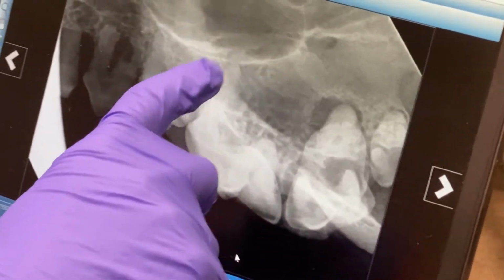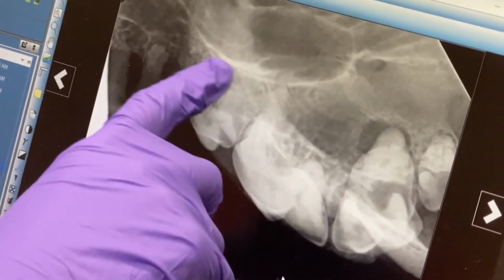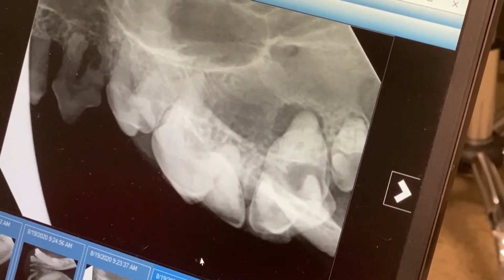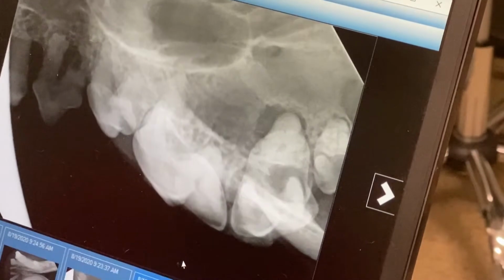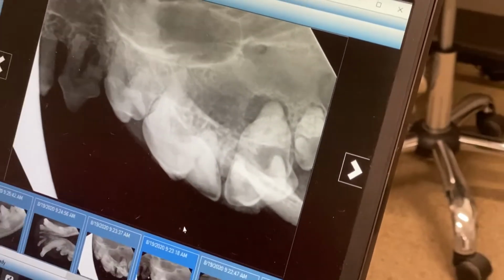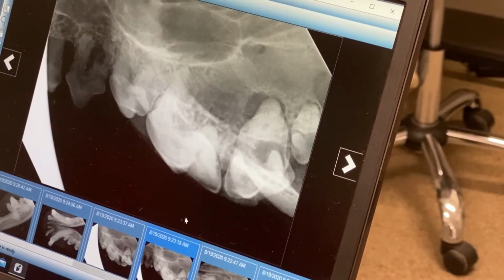This would be normal. This is what we're expecting around some of these other teeth, where you should actually have normal bone that connects down to the periodontal ligament of these teeth. But when we have this periapical lucency, that means that we've actually got bone clearing because there's likely bacteria that's starting to cause infection and eating away.